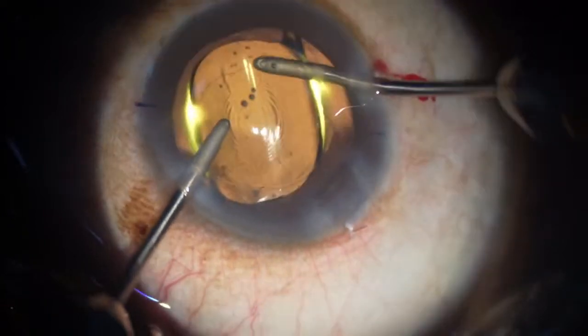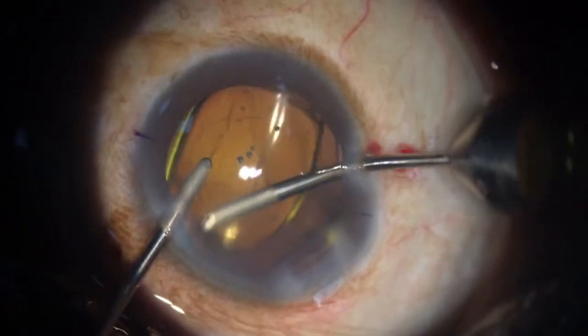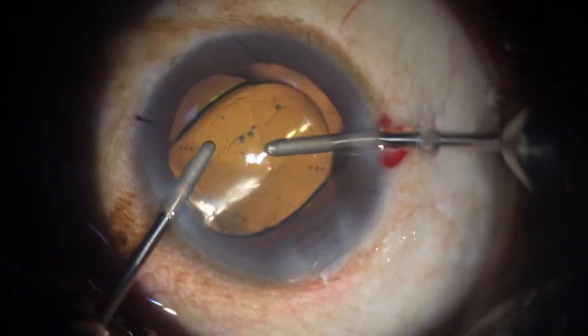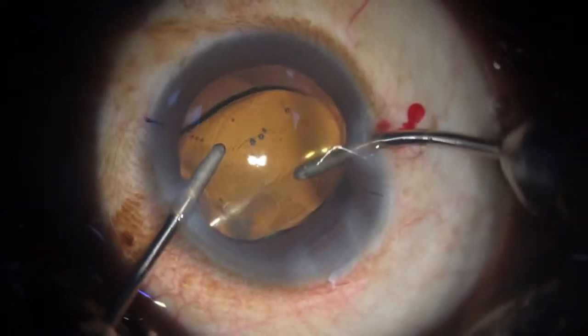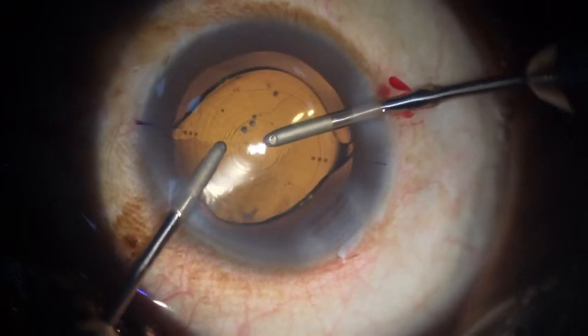The good thing is when you do a hydroimplantation, you have no visco to remove. So no visco is trapped behind the lens, and your chamber remains stable at all times. And the lens centers beautifully. I'm using my bimanual only to rotate it.